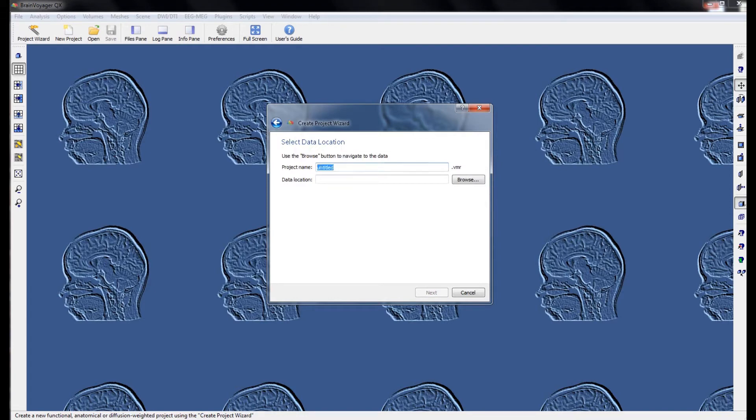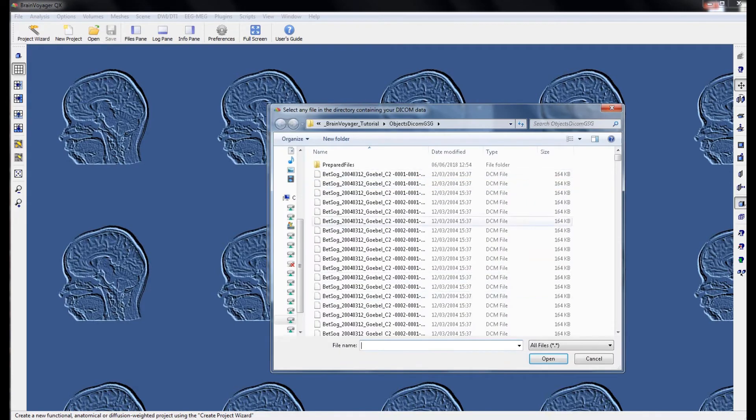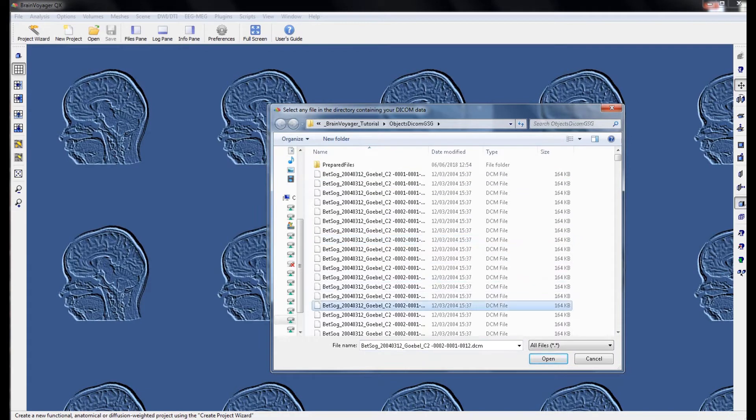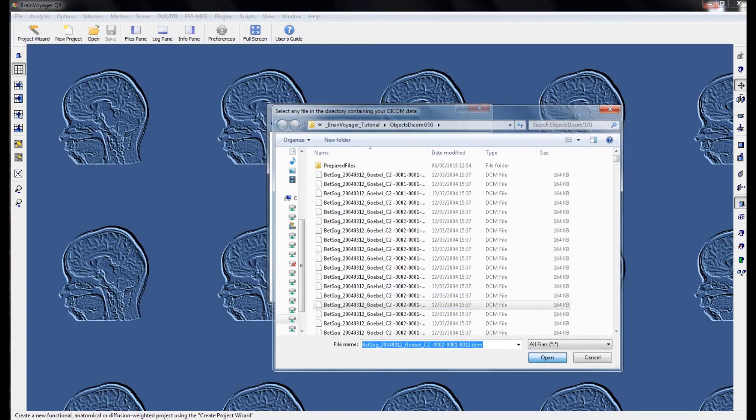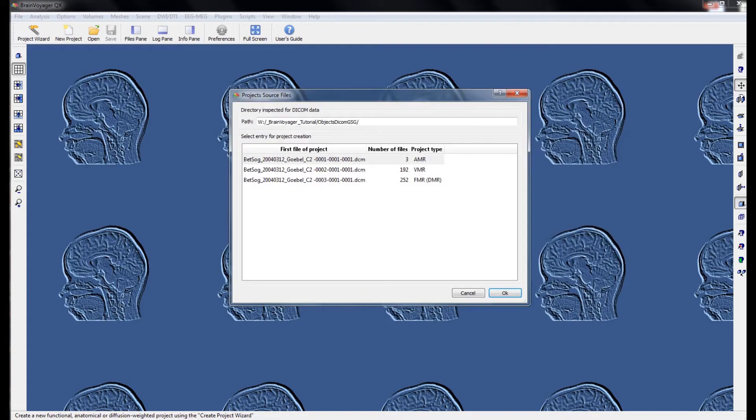For the project name, we want to start with the subject ID followed by an abbreviation for anatomical. When we browse to the folder that contains the DICOMs, we can select any of these files. From here, BrainVoyager will open a window showing the scans that are contained within that folder.